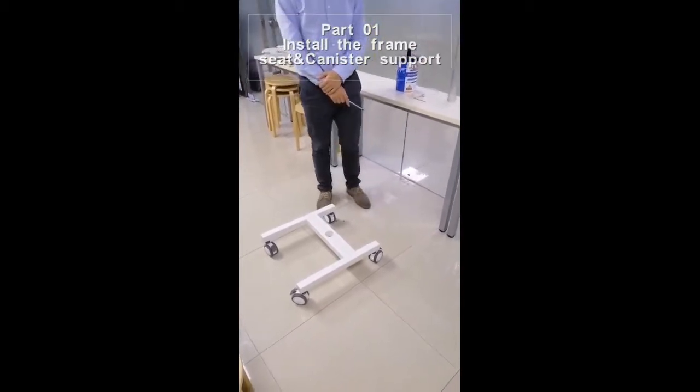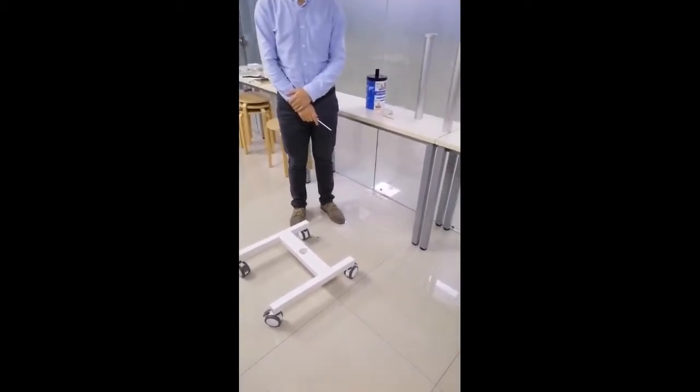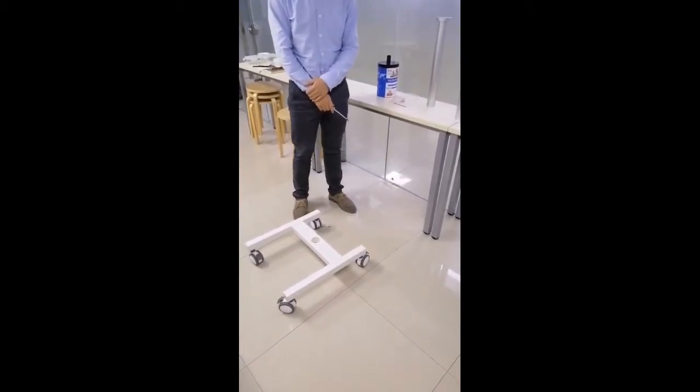Now I will show you how to install our R640 in a stationary chain.